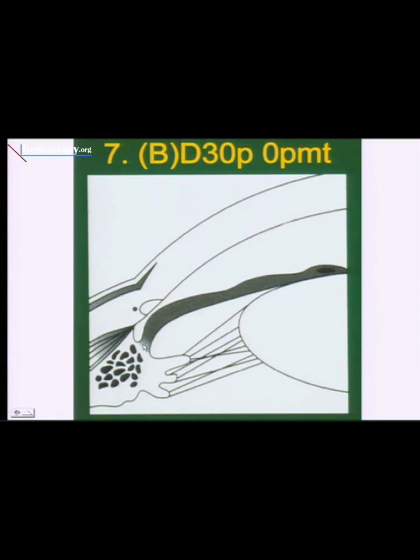Now, are there disadvantages to gonioscopy done with an indentation technique? Yes, there are. There are major disadvantages. And David Campbell, great gonioscopist, great contributor to the field also, was not a fan of indentation gonioscopy. He said what happens is people push against the cornea and inadvertently deepen the anterior chamber and make the angle look deeper than it really is.